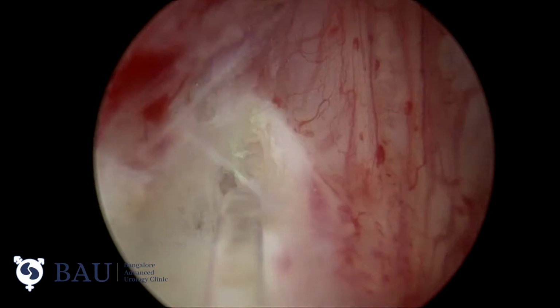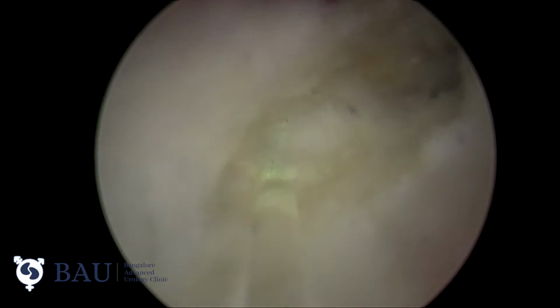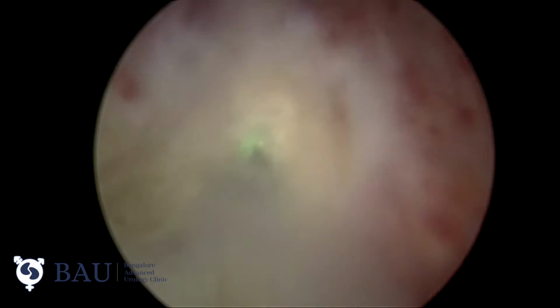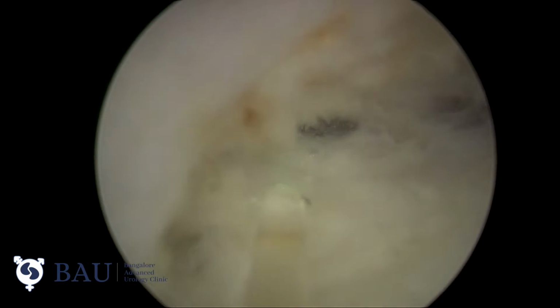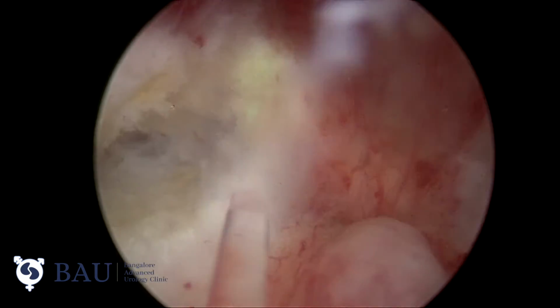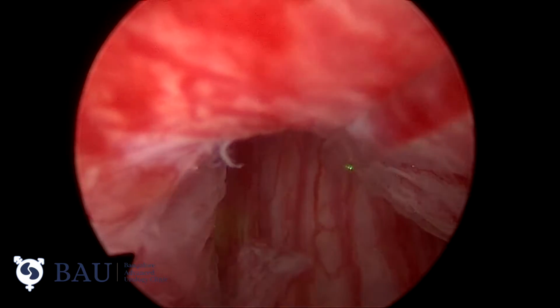We can proceed in the correct plane. Now on the right side of the patient, we open the mucosa, and here also you can clearly appreciate how nicely the lobe is getting separated from the capsule. No need of any mechanical push in this area, and we can clearly appreciate the plane.